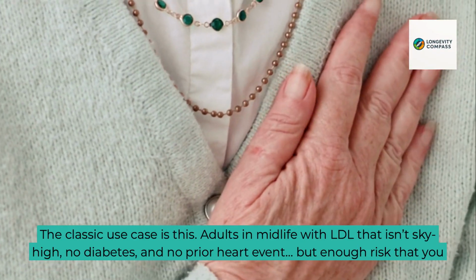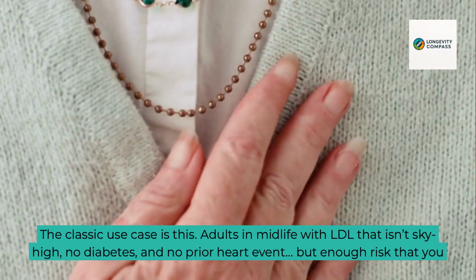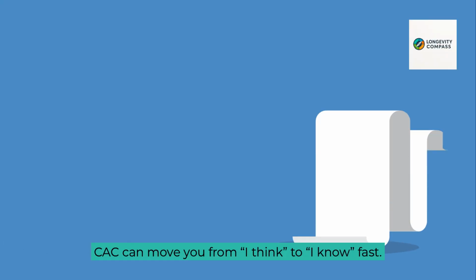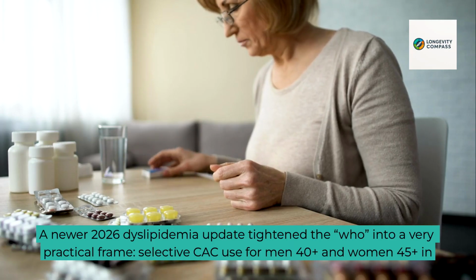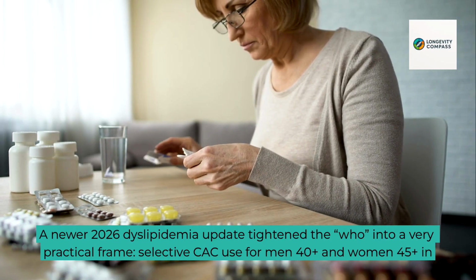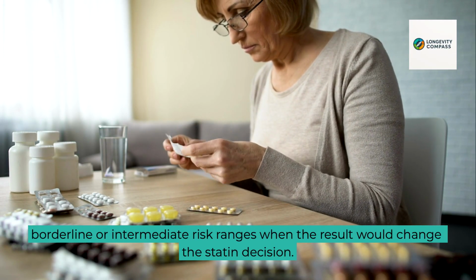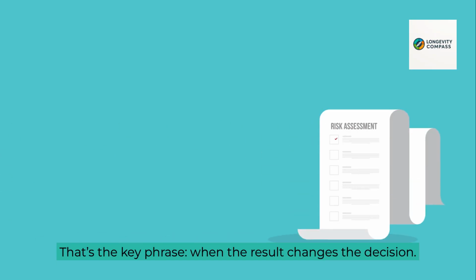The classic use case is this. Adults in midlife with LDL that isn't sky high, no diabetes, and no prior heart event, but enough risk that you can't shrug it off. CAC can move you from "I think" to "I know" fast. A newer 2026 dyslipidemia update tightened the "who" into a very practical frame. Selective CAC use for men 40+ and women 45+ in borderline or intermediate risk ranges when the result would change the statin decision. That's the key phrase, when the result changes the decision.